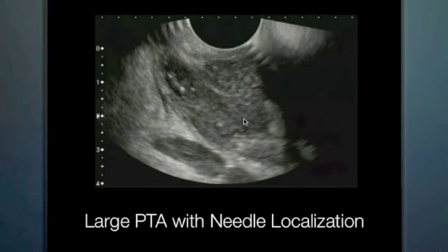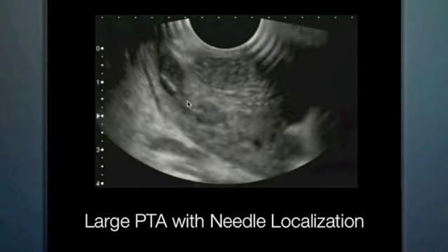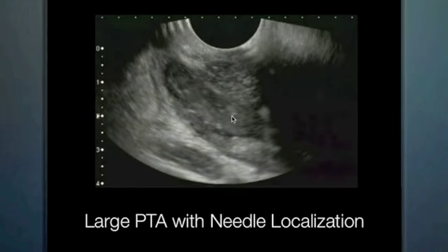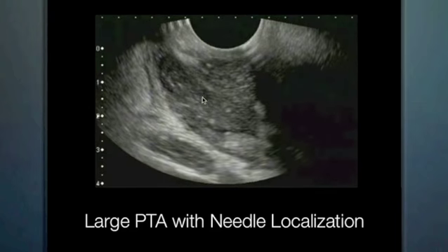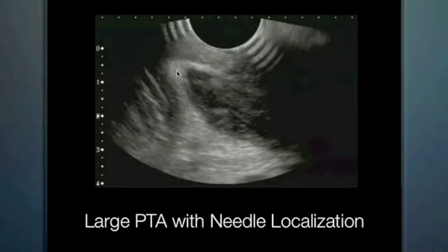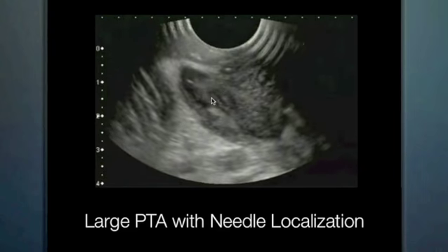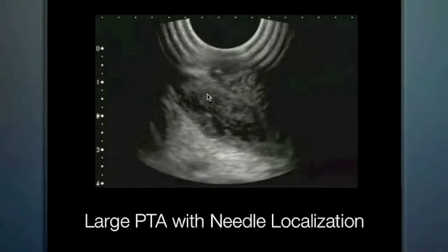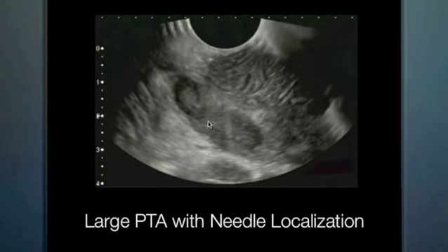And this is very helpful, being able to see this very large amount of pus and this very severe degree of a peritonsillar abscess. You may find that some of these are so large that they're very easy to drain, or that they're so extensive that they may need to be drained in the operating room for maximum comfort and securing of the airway. However, ultrasound does help to differentiate how difficult or easy a drainage procedure could be.